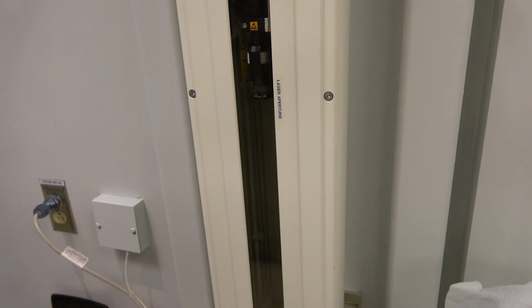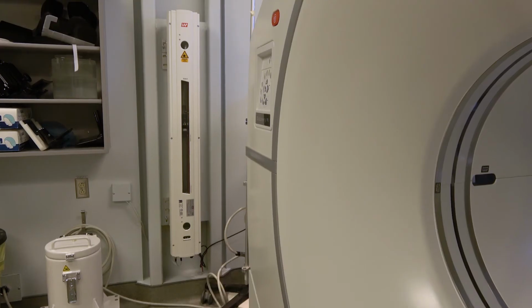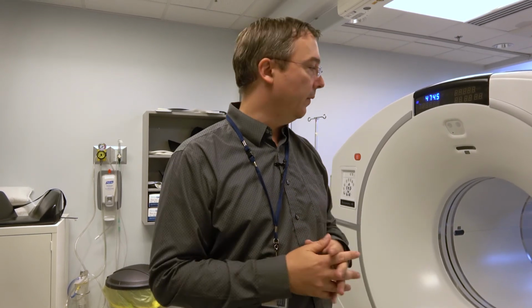We can use it to plan radiotherapy. So if someone's going to be having treatment for a cancer, we actually have lasers on the walls here that can help them line up in exactly the same position that they would be in when they're getting their radiotherapy treatment. And with the scanner, the scans probably take about 10 minutes these days. On the scanner that we had before, it was roughly 25 minutes. We can usually do a scan in sort of 10 to 15 minutes with the modern scanner.